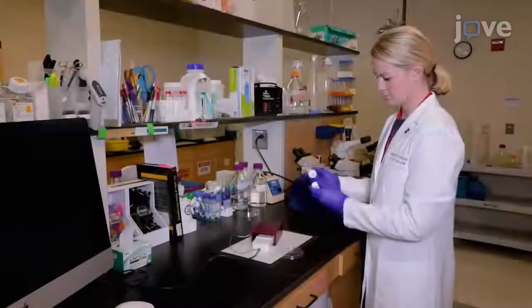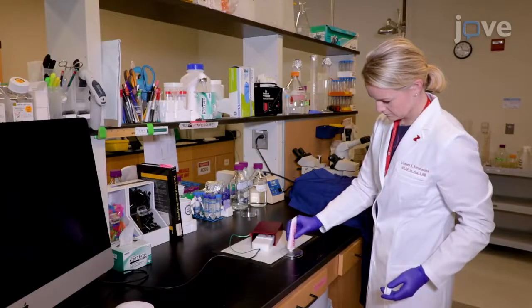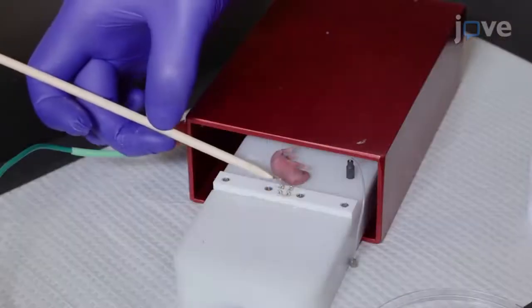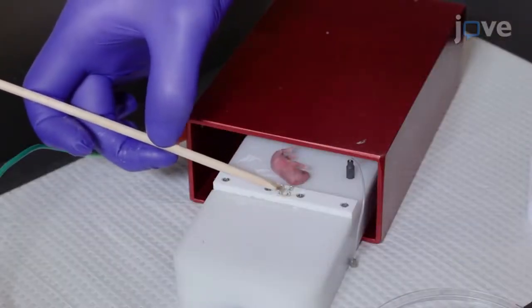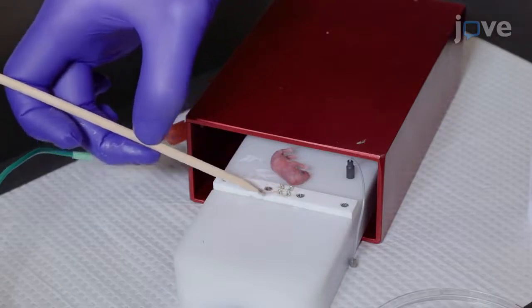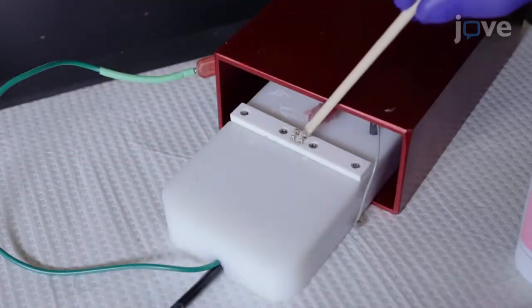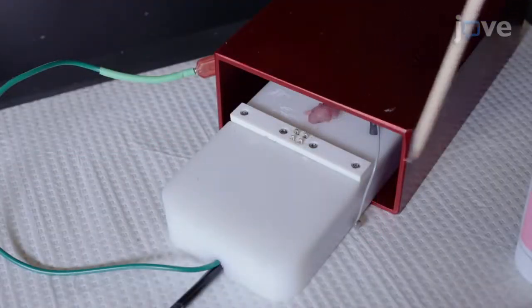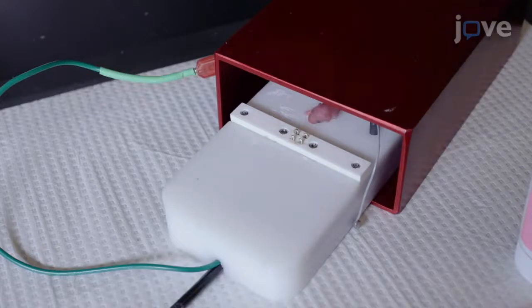While the mouse is acclimating, collect a small droplet of adhesive electrical conducting gel and gently press the droplet down onto the top of each of the four flattened electrode surfaces, carefully pulling the conducting gel away at an oblique angle from the center of the electrode construct after contact.